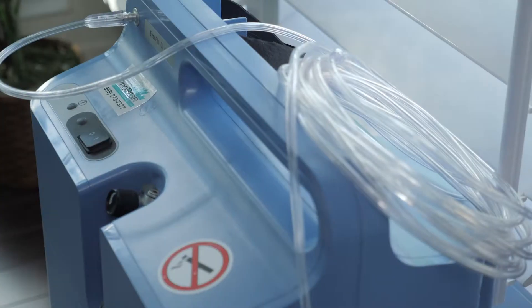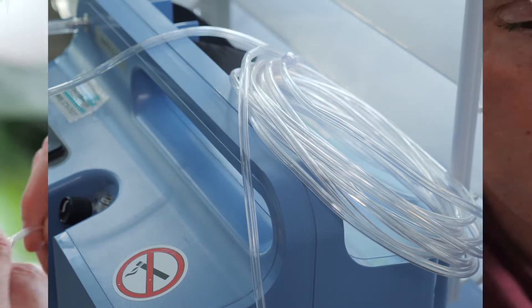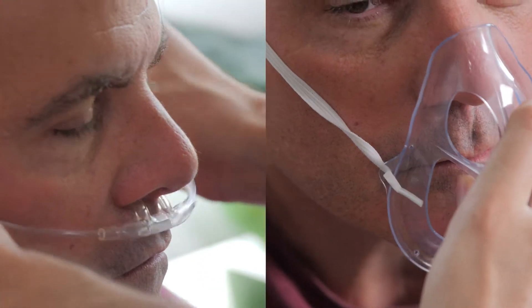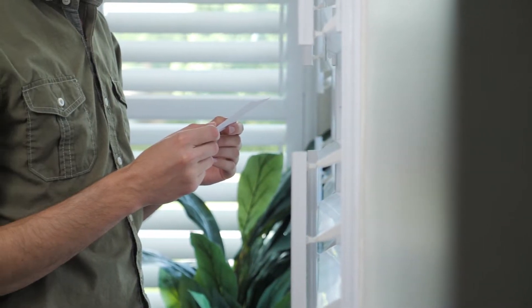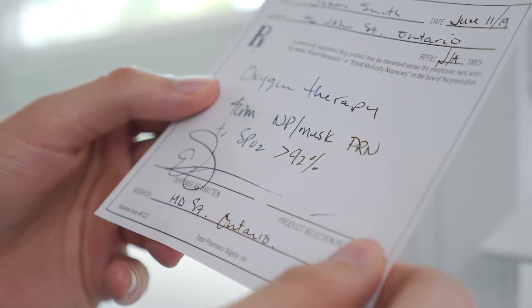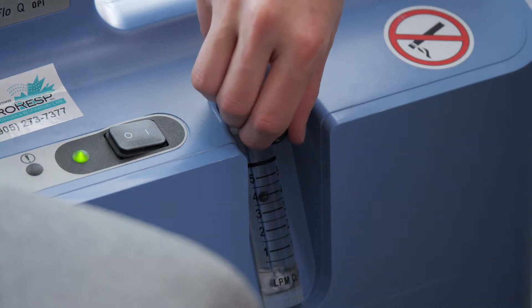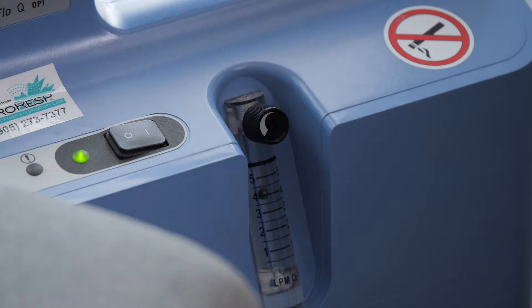Oxygen can come in a tank or in a concentrator. Start by setting that up near the person you're caring for. You'll also need the oxygen tubing their doctor said they should use — usually nasal prongs or a face mask. You'll also need to know how much oxygen the person needs, determined by the doctor and written as the number of liters of oxygen per minute.